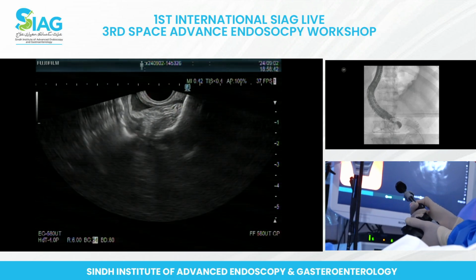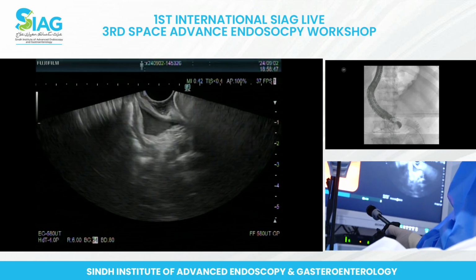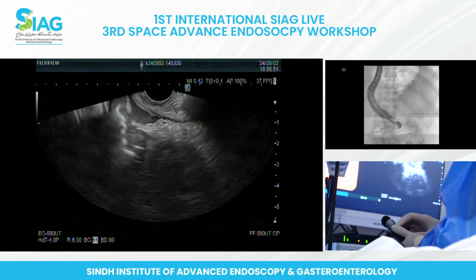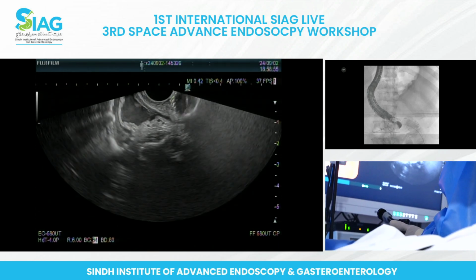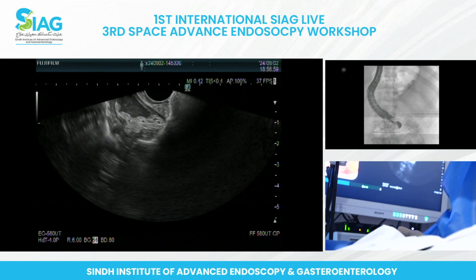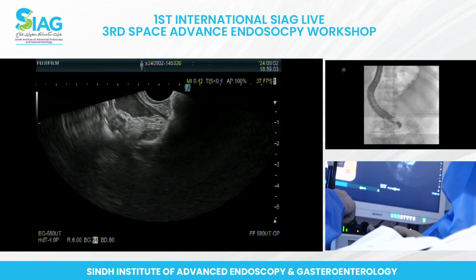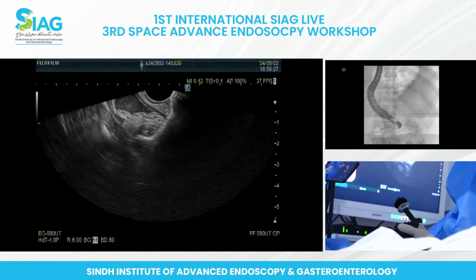So you release the proximal end of the stent into the scope, and then you pull back the scope. Yes, you have to pull back. The stent is deployed, you just can't see it, unfortunately. So can we do the endoscopic view now, please? Can we move the room camera to the endoscope, please?